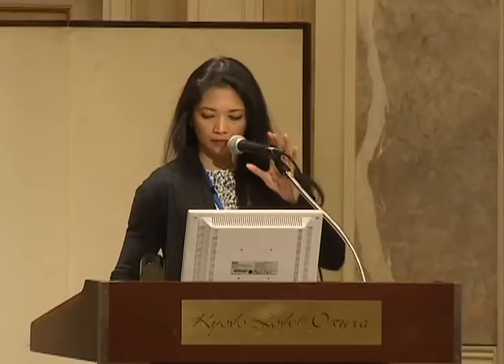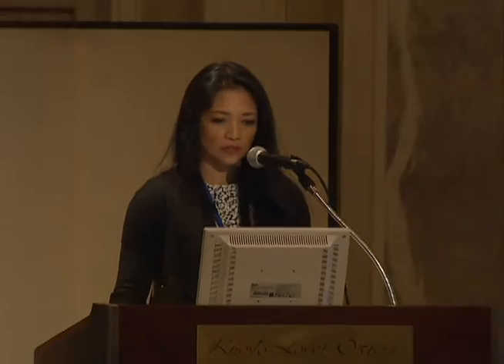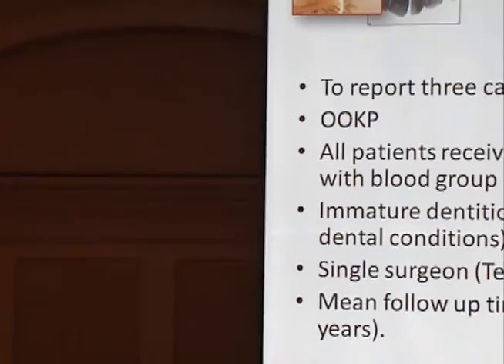Good morning. Thank you for accepting this paper. It's a pleasure for me to represent my team from Barcelona. So I would like to report on 3 cases of severe alkali burns. All patients underwent osteodontokeratoprosthesis. All patients received living-related donor tooth with blood group compatibility.